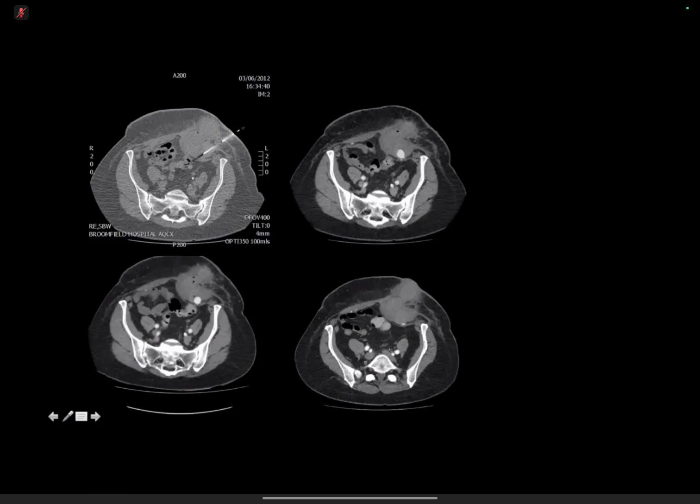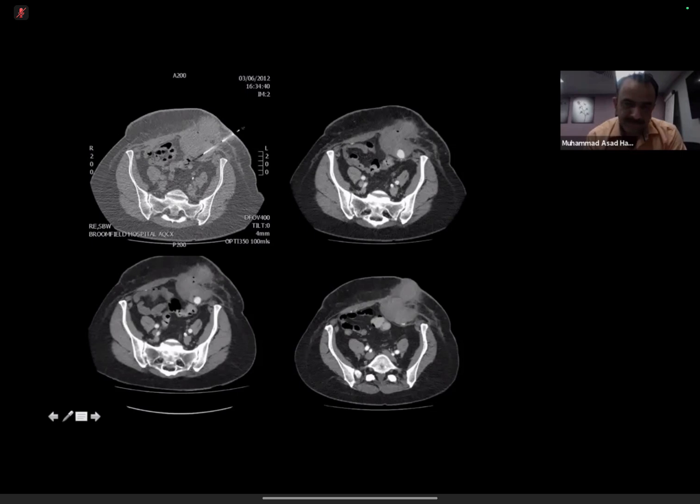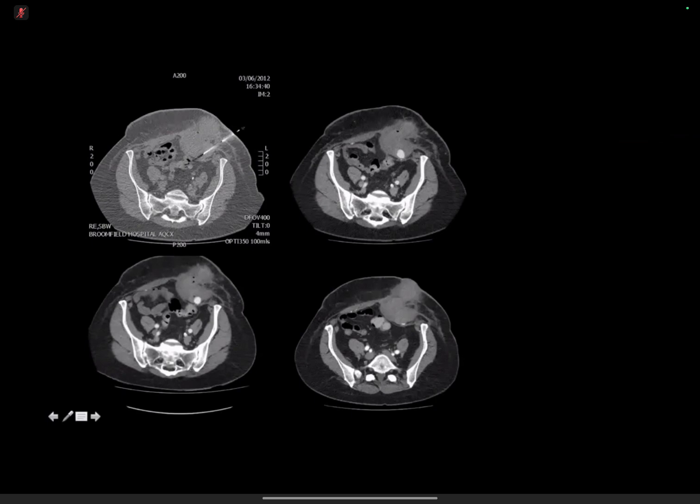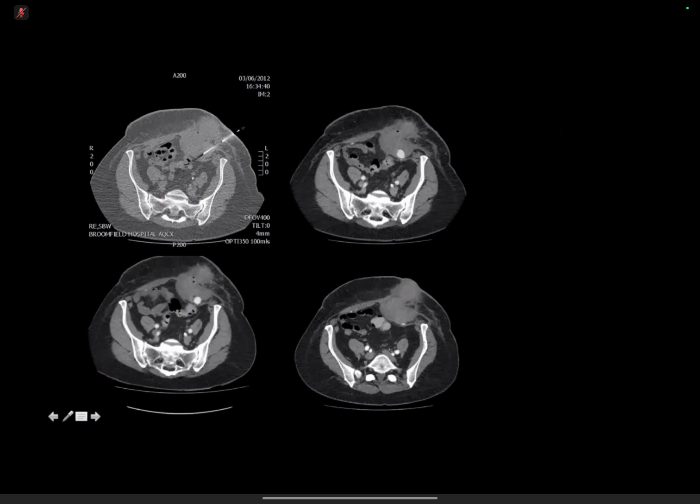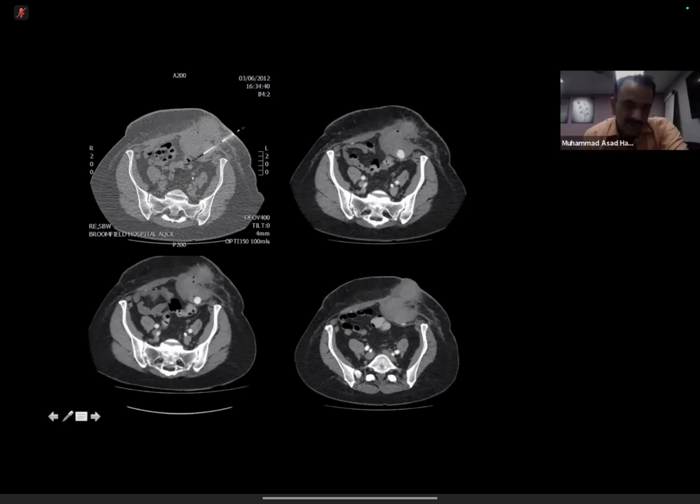Yes, we can use thrombin injection. Good. Very good. Is there any other method? It can be called like maybe glue, maybe. Yeah. So, in addition to the coils and thrombin, especially in case of the common femoral artery pseudoaneurysms, ultrasound-guided compression. You can also employ that.